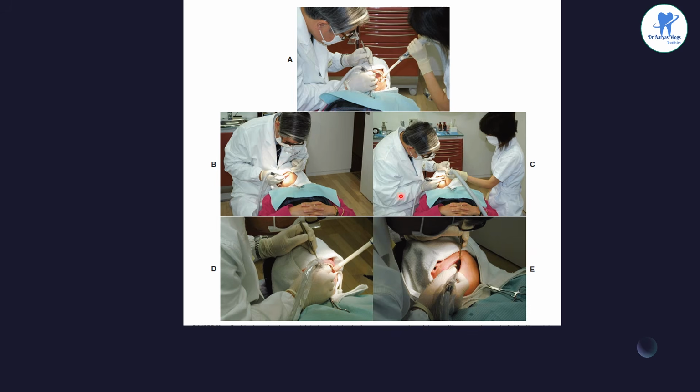dentist's direct vision. Here the maxillary left posterior sextant, buccal half of the occlusal surface reduction: the dentist is at the 9 o'clock position, and the patient turns the head to the right to improve the dentist's direct vision. For the palatal half of occlusal surface reduction, including functional cusp bevel, the dentist is at the 9 o'clock position and the patient turns the head to the left to improve the dentist's direct vision. Here the maxillary left posterior sextant, distal surface reduction.